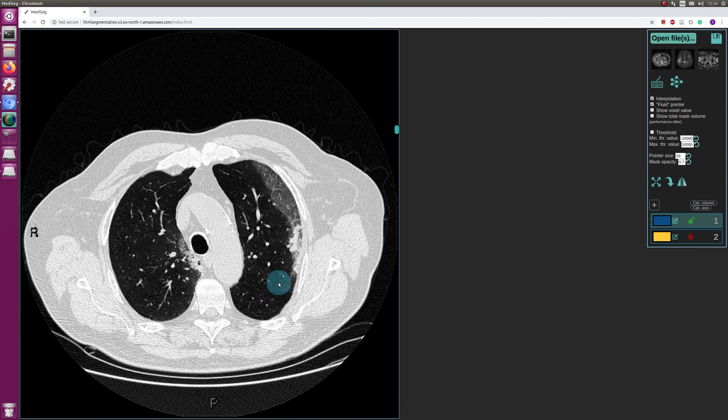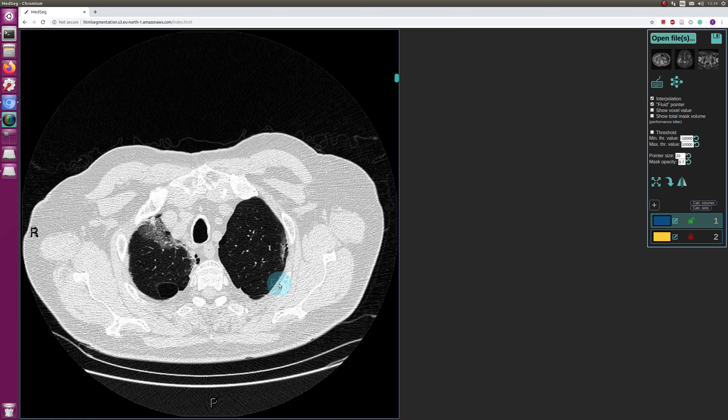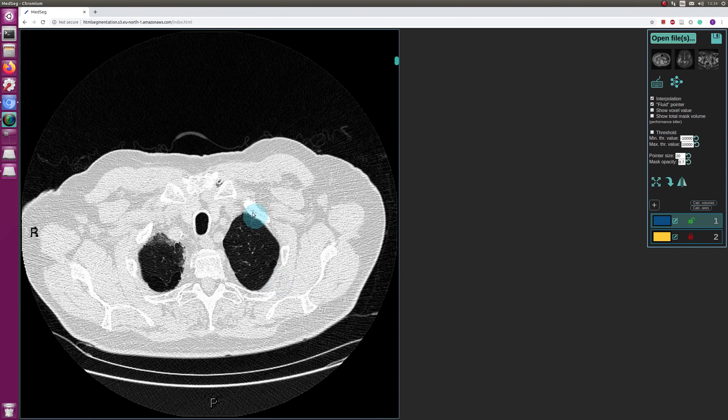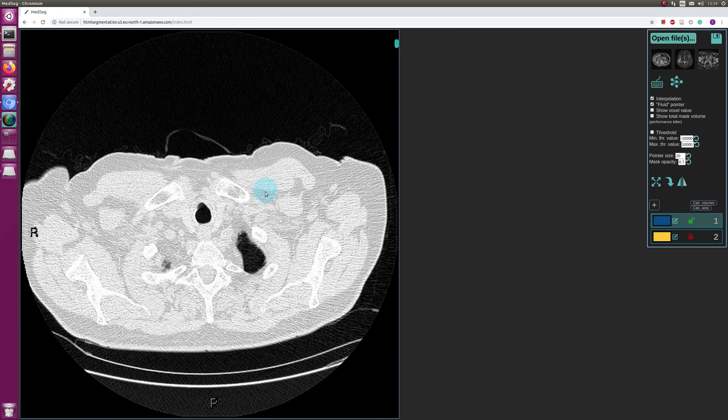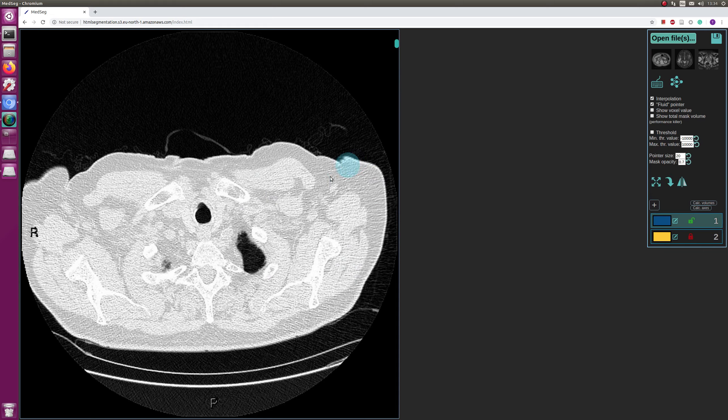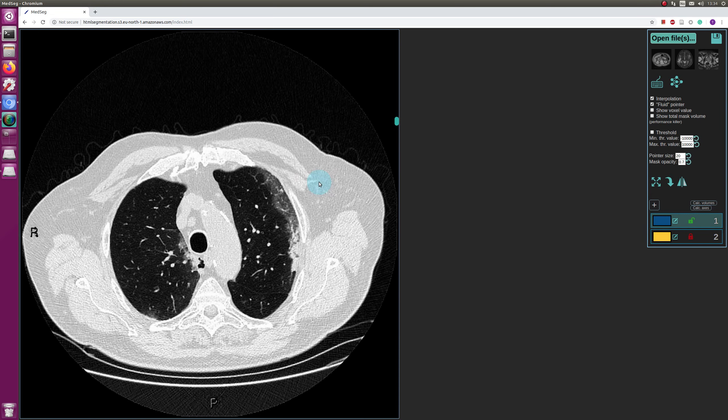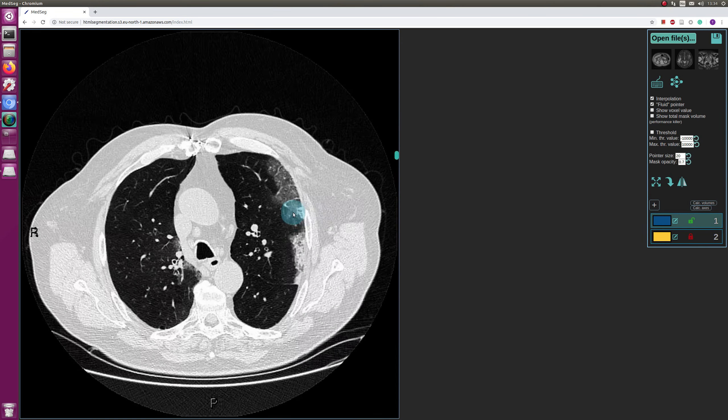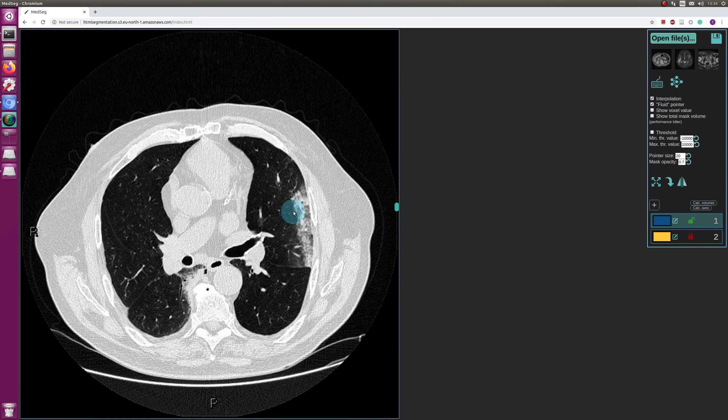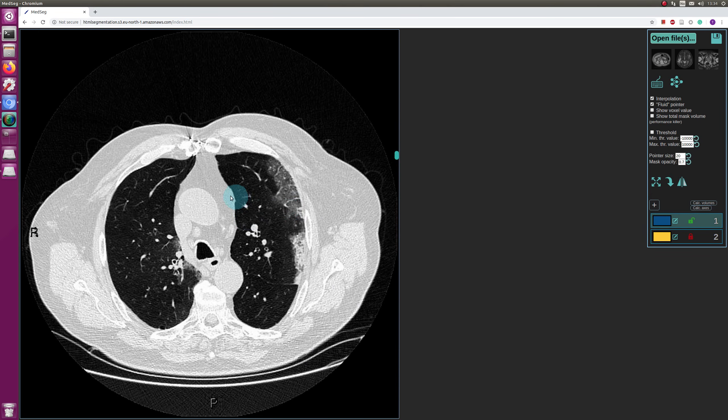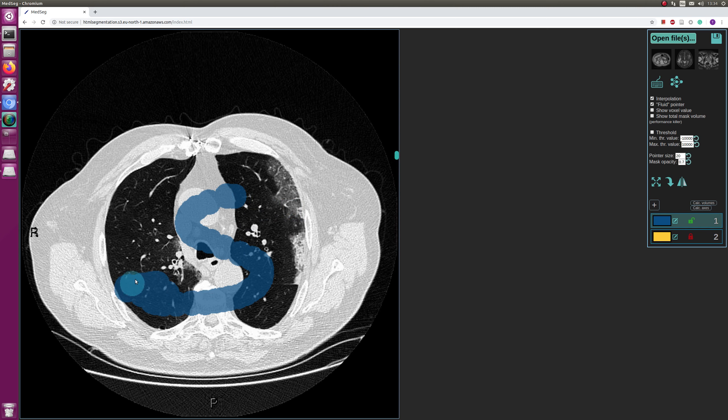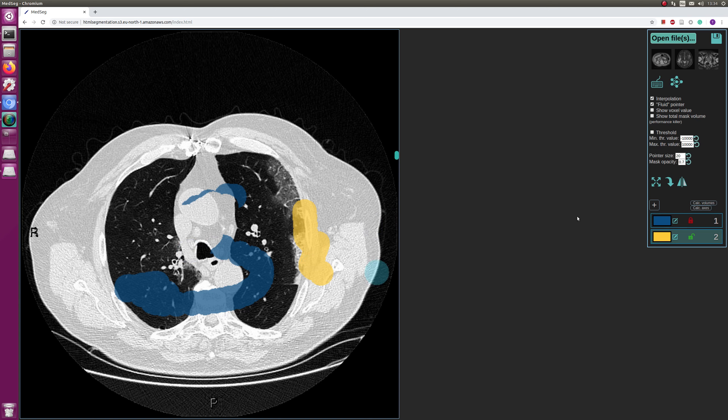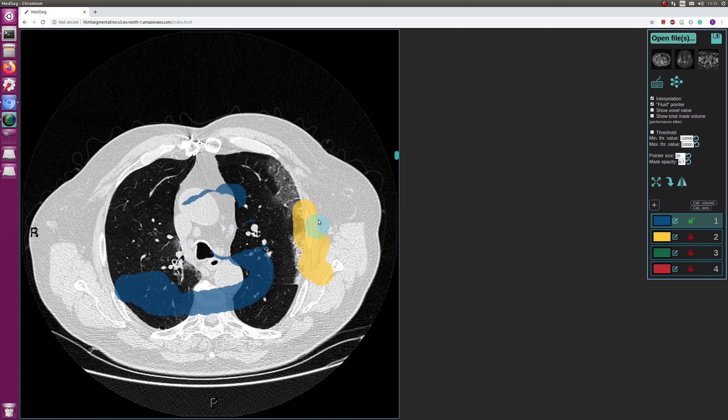I scroll up and down on the scroll wheel. You do segmentation with the left mouse key, erase with the right. You can change labels, you can make additional labels and so on, but now we're going to do the lung segmentation.